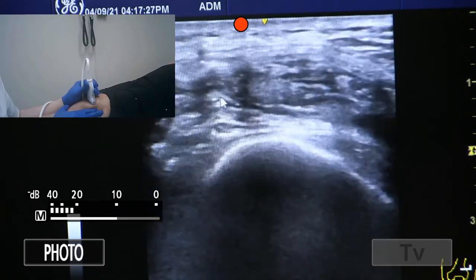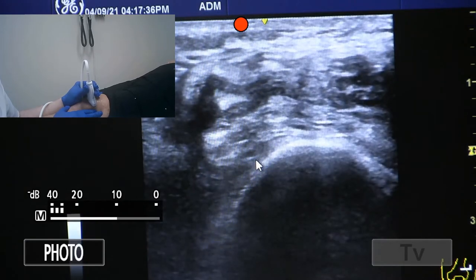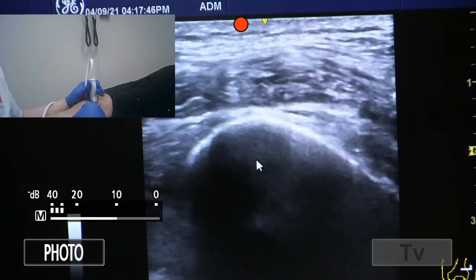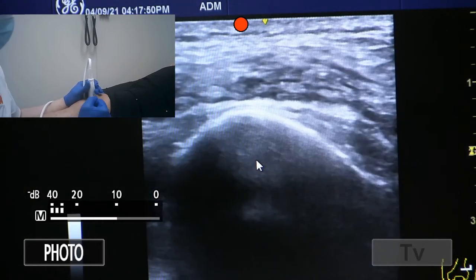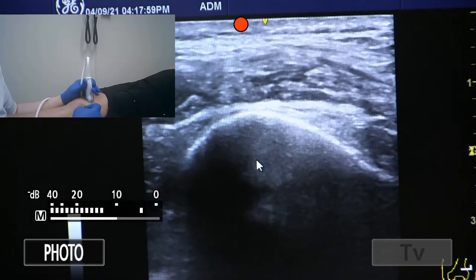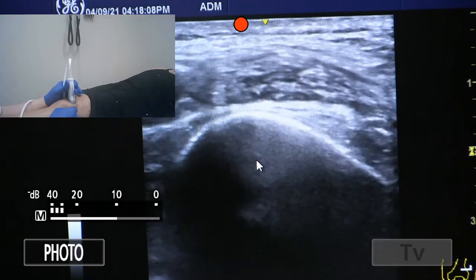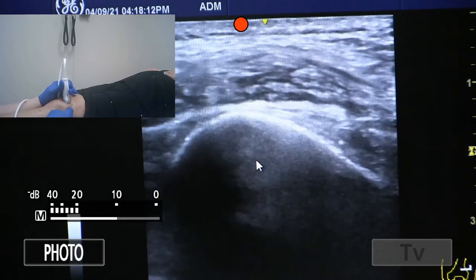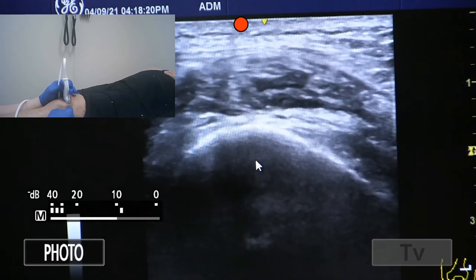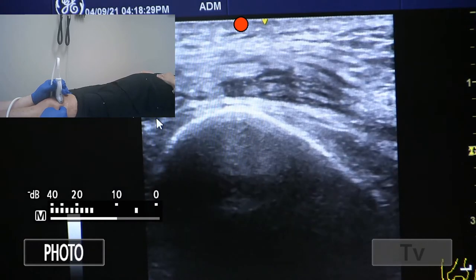Turning to short axis, we can see the femur, and pushing on the lateral aspect we see the effusion pop in as that dark fluid. This is typically where we're going to inject — the superior lateral pouch, about an inch above the patella and an inch lateral. With ultrasound you can correlate depth, targeting about one to one and a half centimeters. Pushing shows how the joint space moves — a good way to prep before your injection and mark the spot.